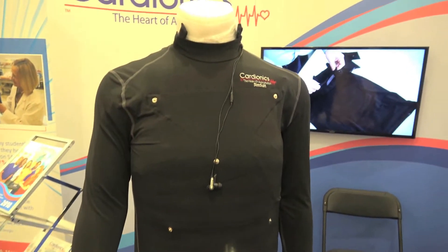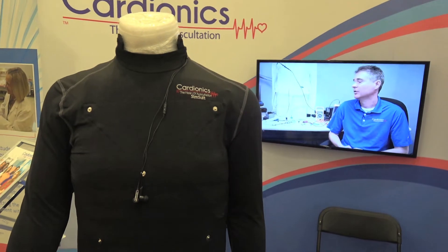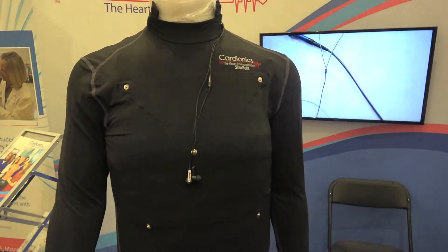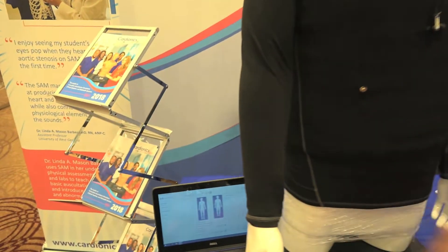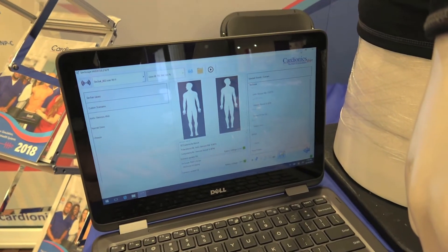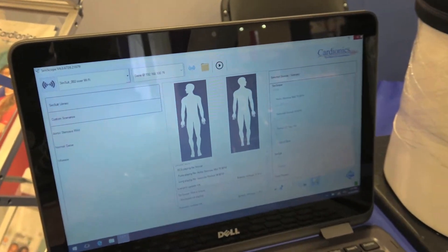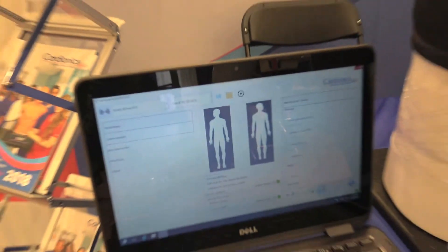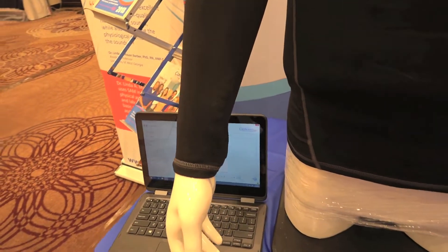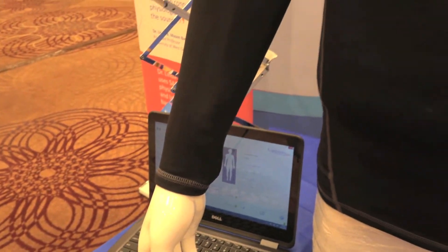On top of auscultation, the SimSuit also has vital capabilities. You can hook up any ECG to it, and with the tablet that comes with the SimSuit, you're essentially able to manipulate the ECG to show the corresponding pathology that you want for the standardized patient. It also has pulse points so you can feel the pulse of that standardized patient during the simulation.